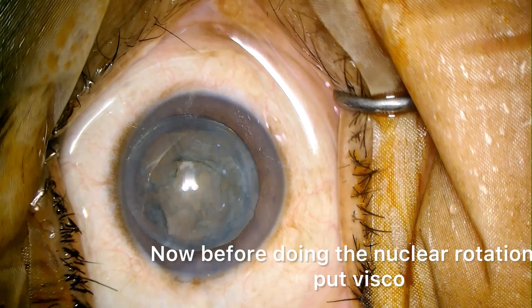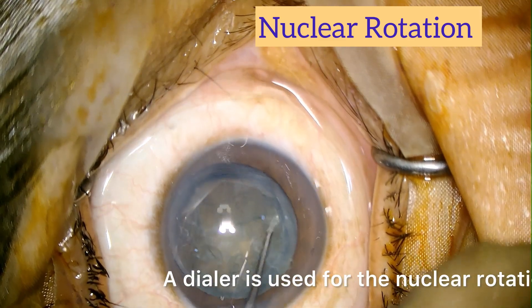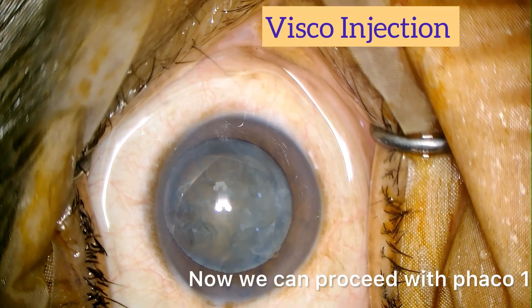Now before doing the nuclear rotation we put visco. A dialer is used for the nuclear rotation and the nucleus is freely movable. Now we can proceed with phaco 1.